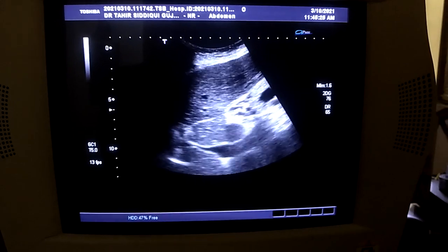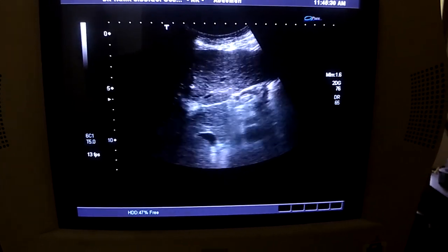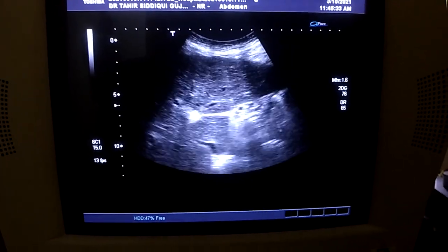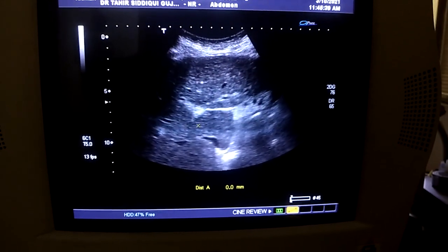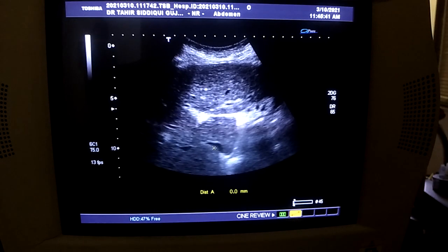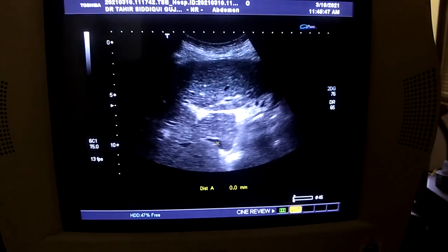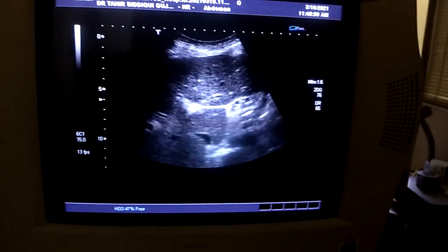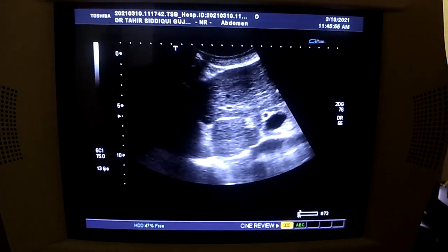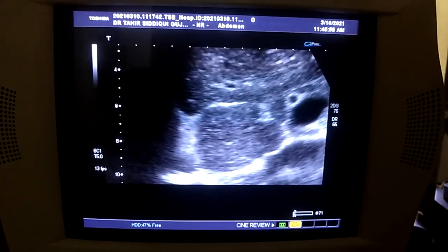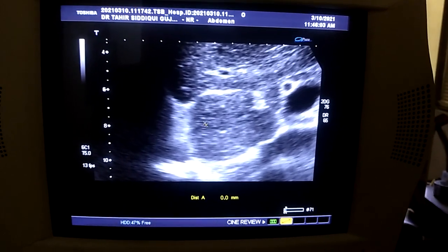Now I am going to give it a sweep of 90 degrees. Let's see in transverse section. This is the transverse section of the same. You see here that this is the caudate lobe in transverse section. This is the ligamentum venosum. Anteriorly, posteriorly, IVC is the landmark. This area is what has been labeled as mass — as I have shown you, it is the caudate lobe of the liver with IVC running posterior.